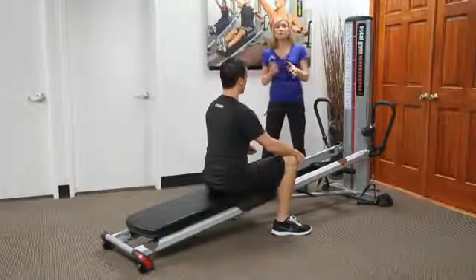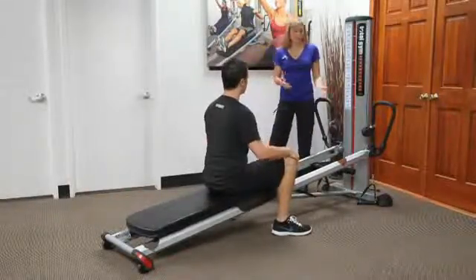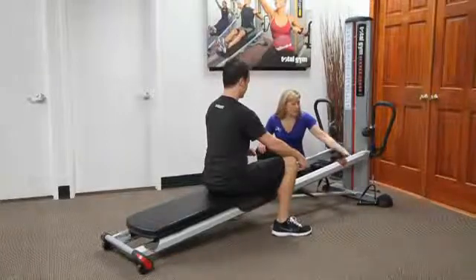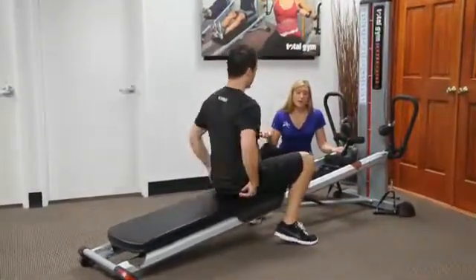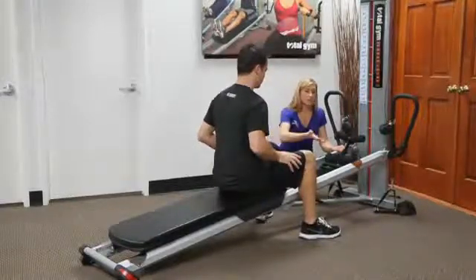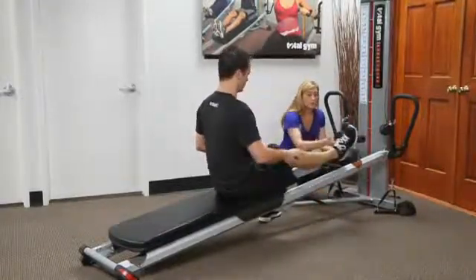Let's talk about how you accommodate for strength when using the foot holder. So first of all, the foot holder lies in between your rails. You just pull it up into position. So you're going to have someone, if they have long enough legs, they can just turn their foot out and reach one foot into the foot holder.